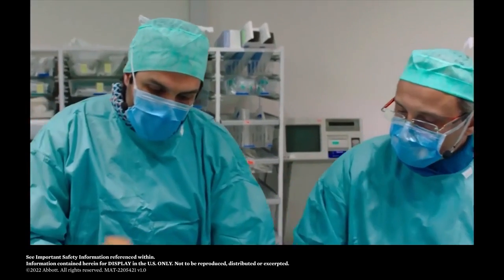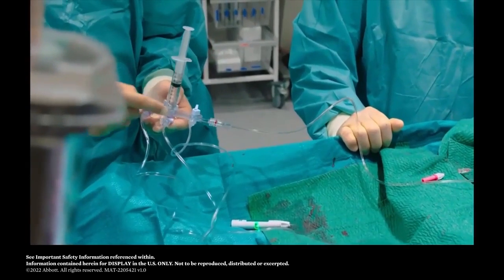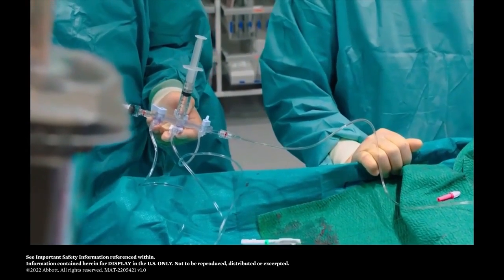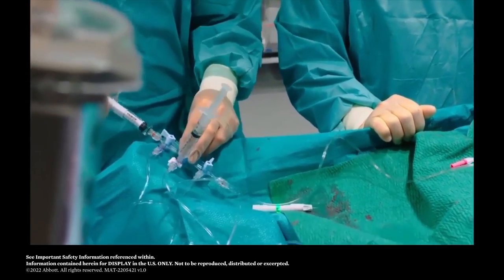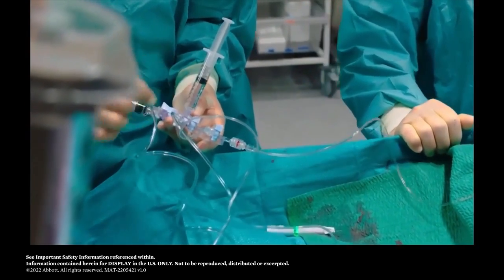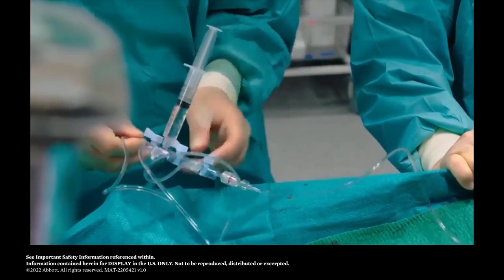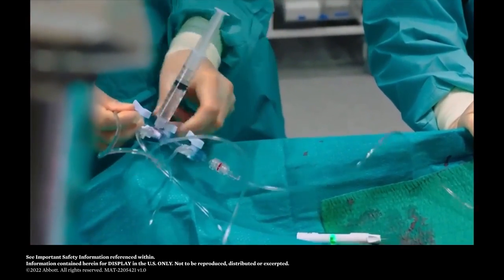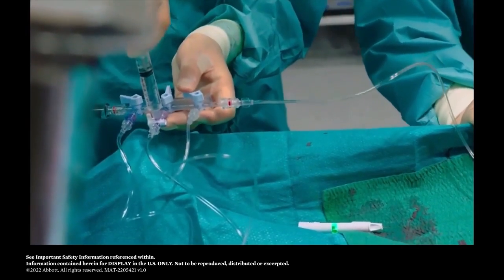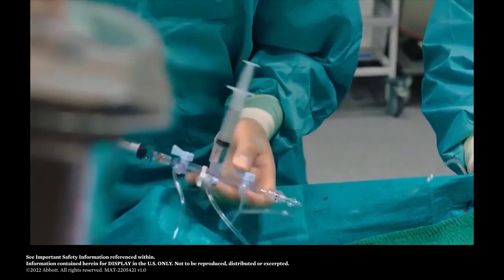So I'm going to start with the administration of papaverine. You see here that it is completely transparent because we have not mixed the papaverine either with contrast or heparin. Then I'm going to prepare to administer 12 milligrams of papaverine into the left coronary artery. This is approximately 3.5 cc in our dilution. So I'm going to take the time to look at my line, and I said 3.5 cc's. This is going to be enough.